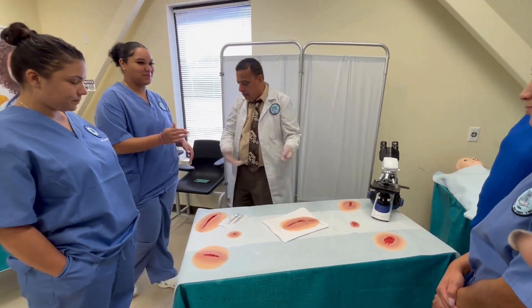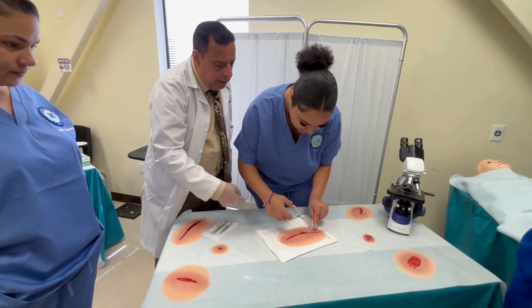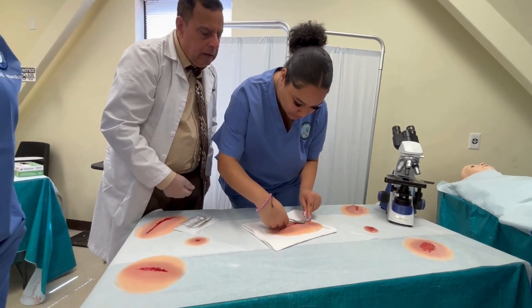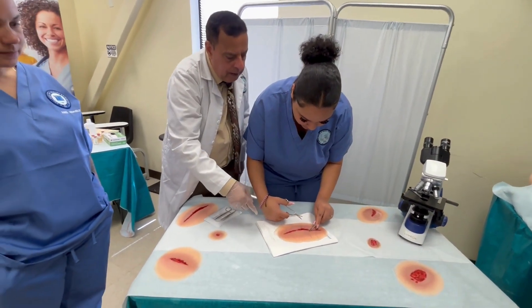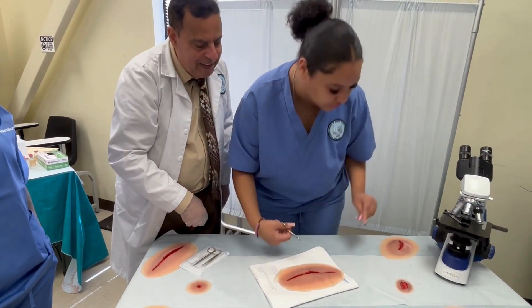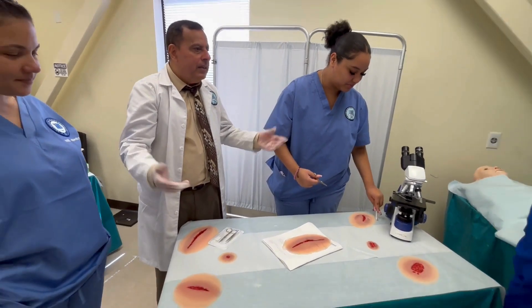The student practices: slide the scissor tip underneath the stitch, lift this part up, and cut it from below. Excellent job! This is how you do it.